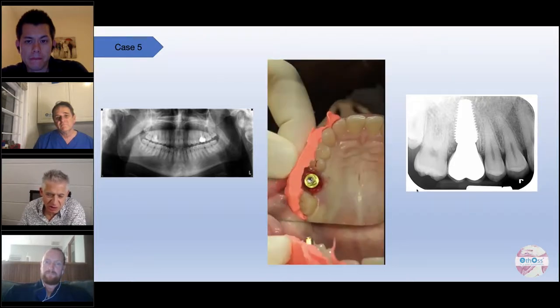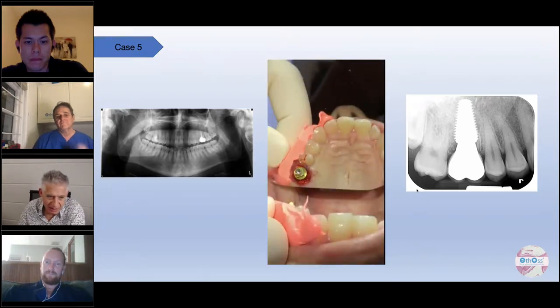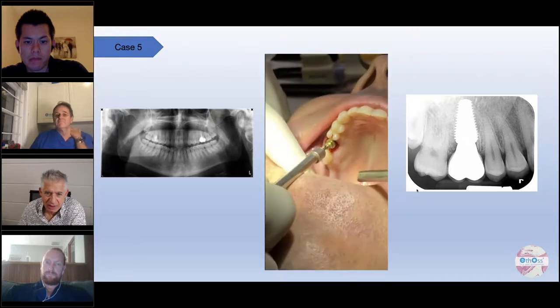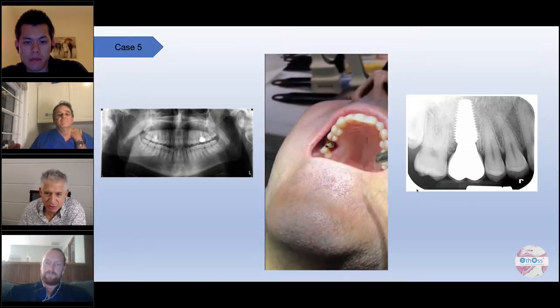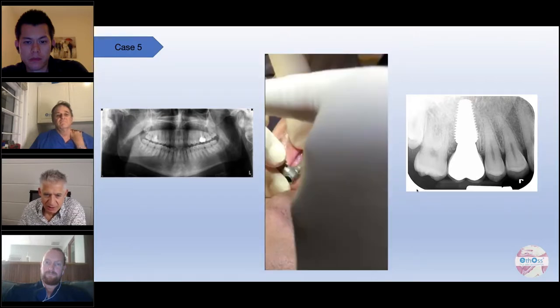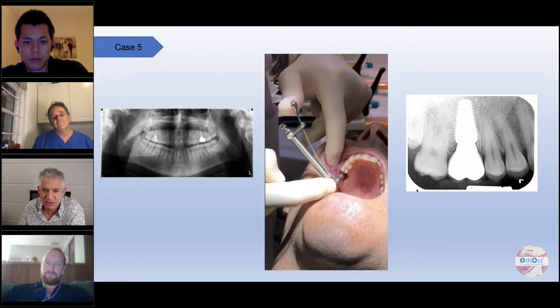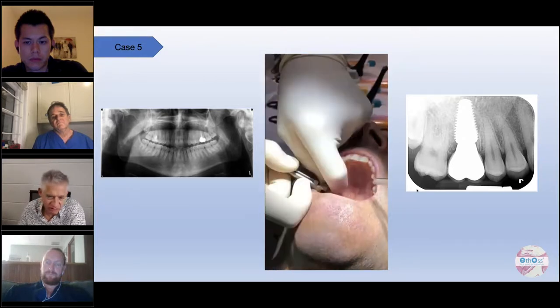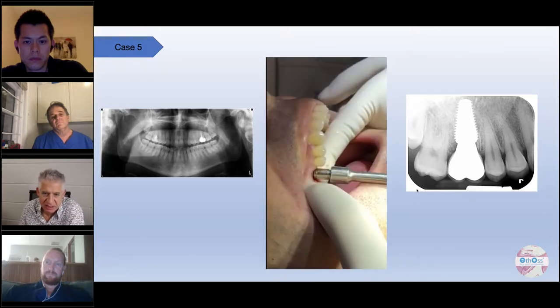And this is the surgical guide that I showed earlier on. It's the bite registration material guide that we make before we extract the tooth. Tighten the fixture mount, make sure that it doesn't come loose because we want to apply some high torque, and again 100 Newton centimeter primary stability. So of course, with 100 Newton centimeter primary stability, we can load these cases.